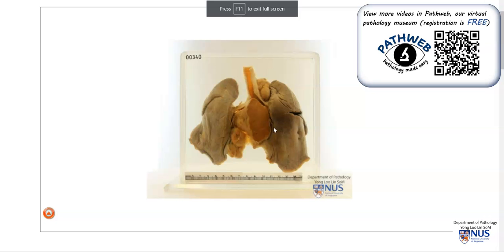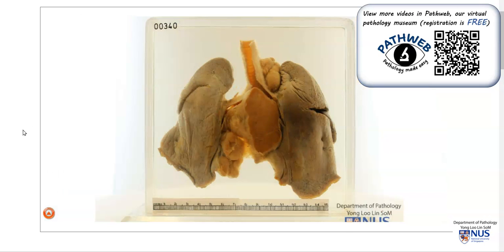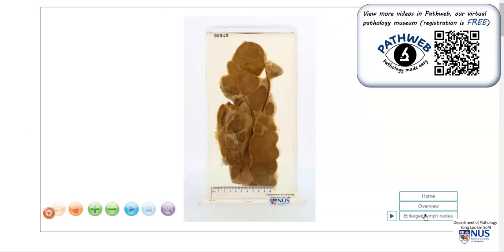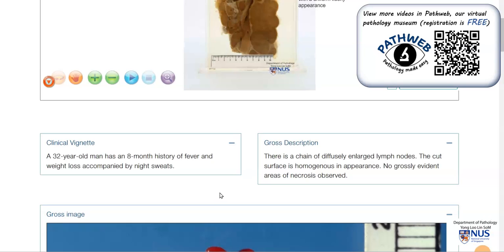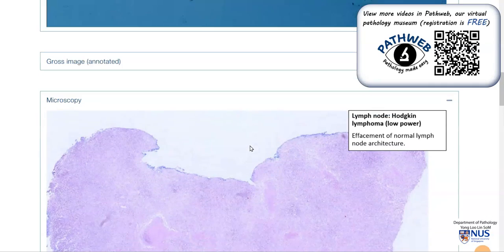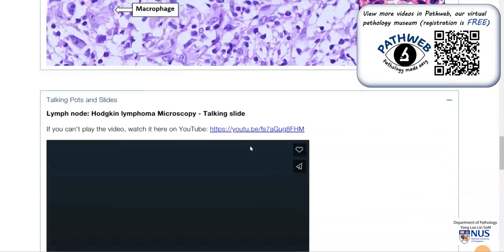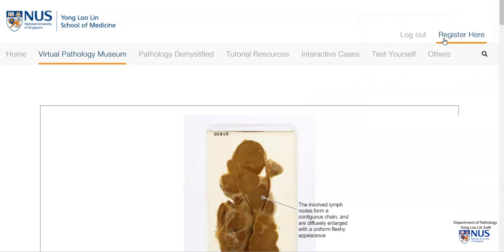Here is another example of Hodgkin lymphoma involving the mediastinal lymph nodes. There is a separate video describing this case. These virtual pathology specimens are fully interactive, and you can maneuver and magnify them. If you scroll down, you can also see additional useful information such as clinical vignettes, gross description, and microscopic annotated pictures and videos. There is an accompanying video showing the microscopic features of classic Hodgkin lymphoma. You can register for free, and the link is in the video description.